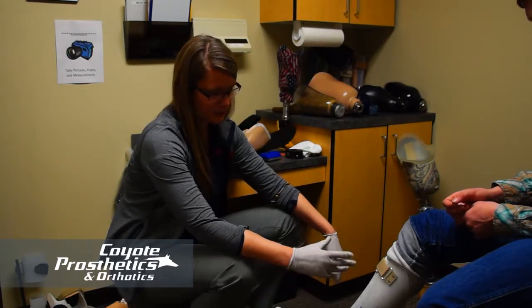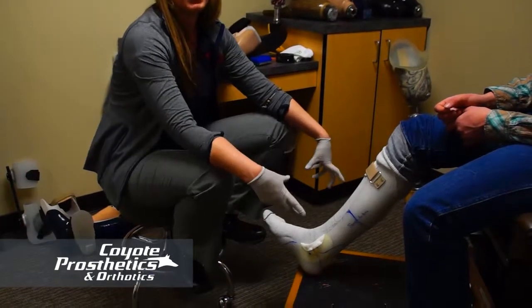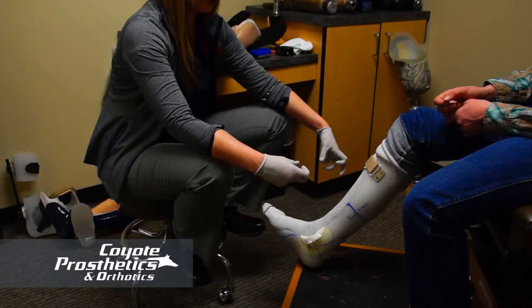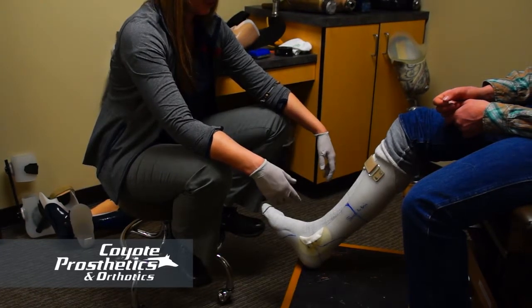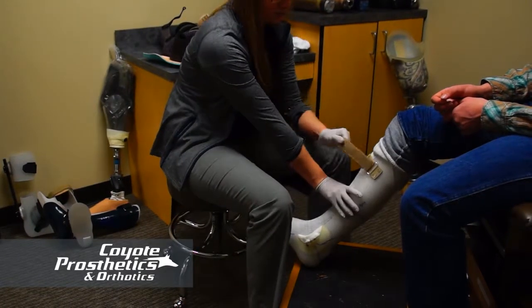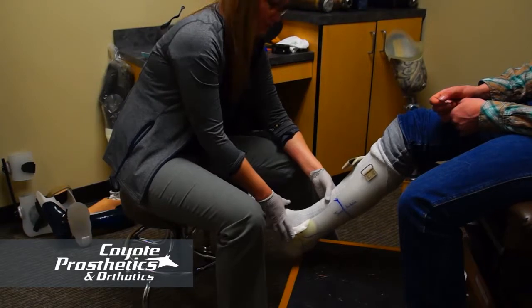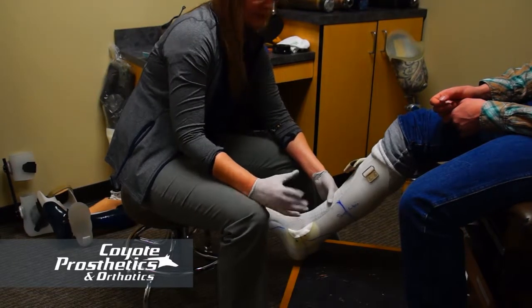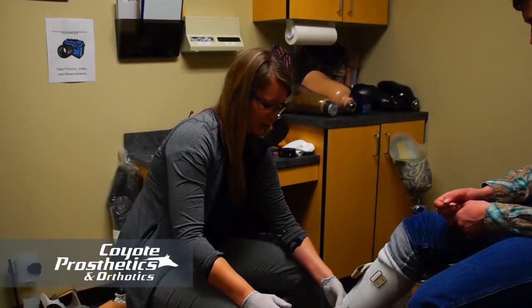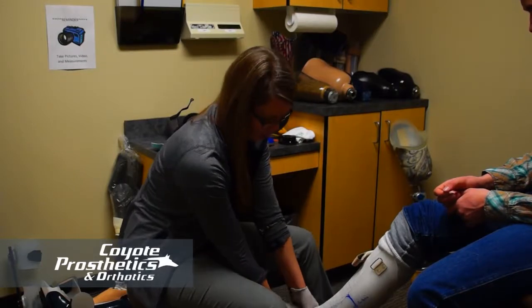As far as cleaning the device, this one is plastic so you can wipe it down with a damp cloth and maybe use a mild soap, but make sure you don't get a lot of soapy residue buildup. For this specific type, you put it on your foot and then put your shoe on. Some braces you can put into the shoe first and then put your foot in, so follow the specific instructions provided for your device.